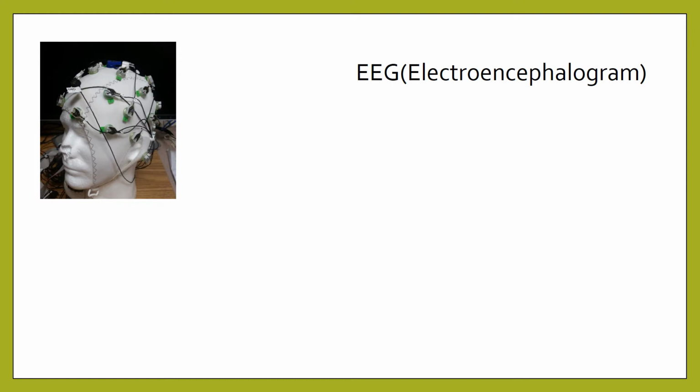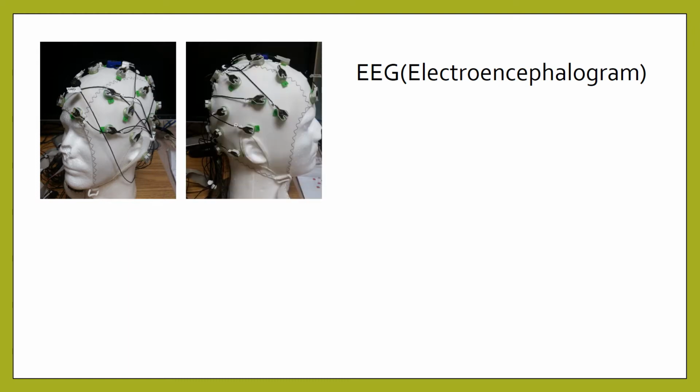The use of conductive gel is important to reduce the impedance between the skin and the electrodes. The amplifier processes the analog signal from the electrodes by amplifying the amplitude of the EEG signal so that the AD converter can digitize the signal in a more accurate way. Finally, the recording device is a computer that stores and displays the data for further processing.